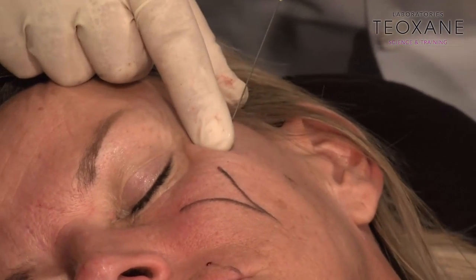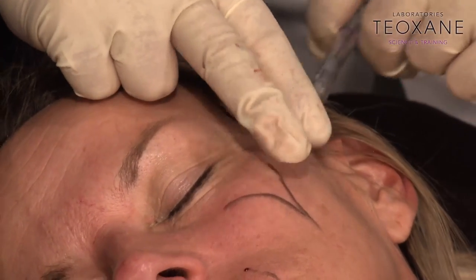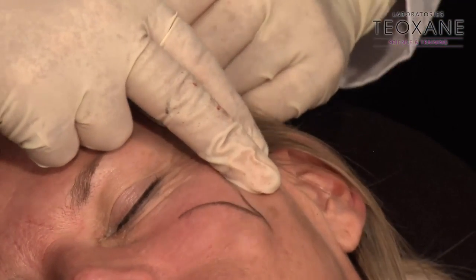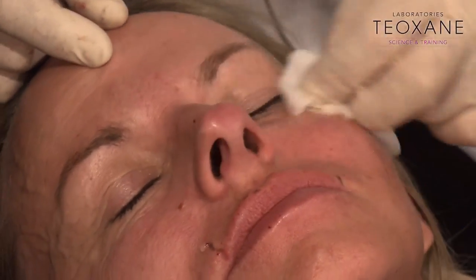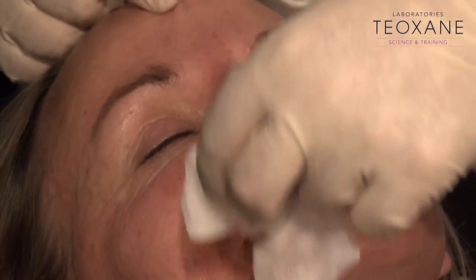Okay. And I want to finish my cheek. Ultra Deep is long, can you? Yeah. You do it. Small refinement on my cheekbones here. I still have my needle all open, ready for me. Voila. So sometimes you need more volume on one side than the other one. So I'm doing some adjustment. I think it's enough. Voila. I think I will have more symmetry and more refinement on the details.